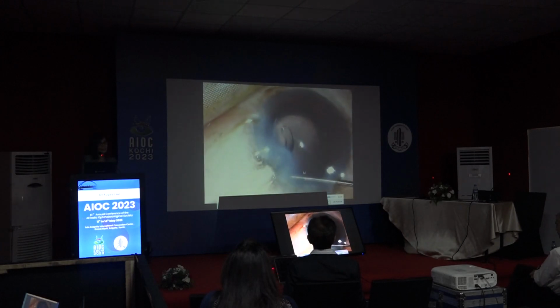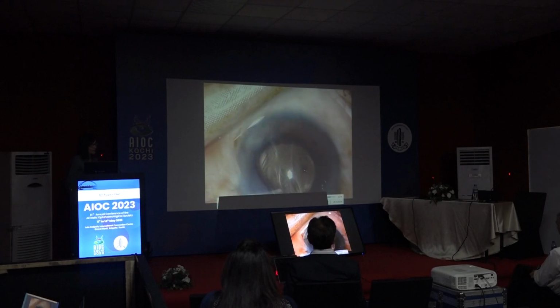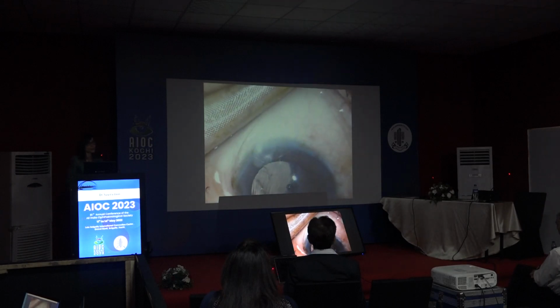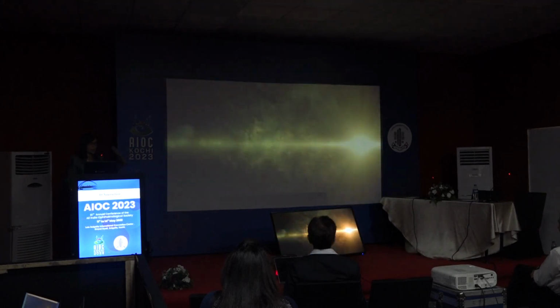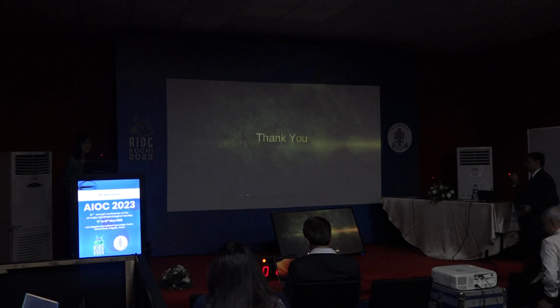Oh, and the plan was for an EDOF lens in the back. And typically in a live surgery, there was no standby 3-piece IOL. So I managed, and then you need them to center well because you can't have a decentered multifocal lens. But to my good fortune, I was able to put the lens in the capsular bag. Thank you very much. This is my experience that I wanted to humbly share with you.